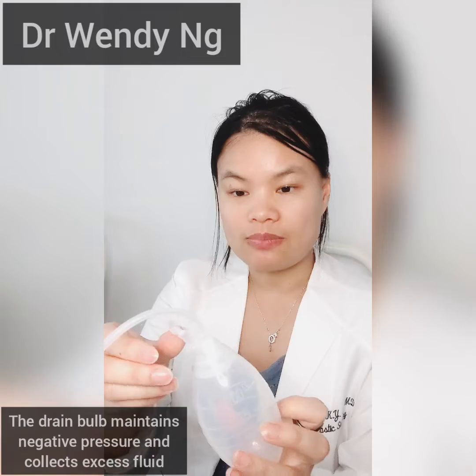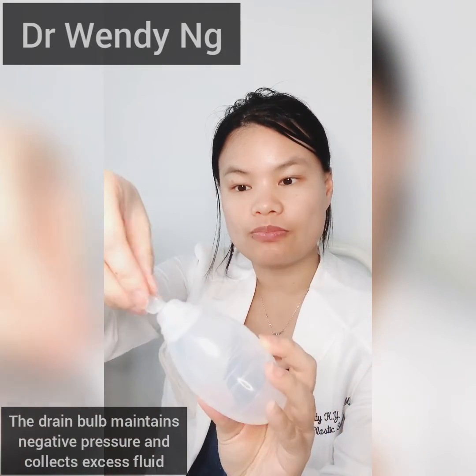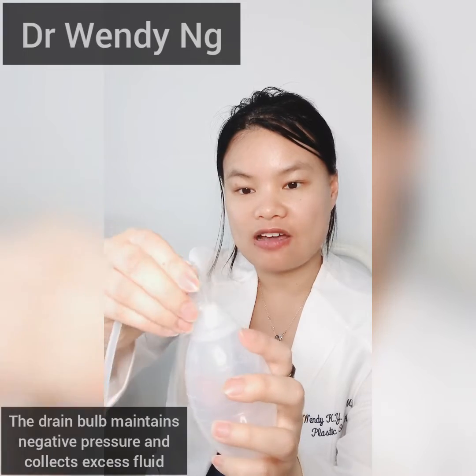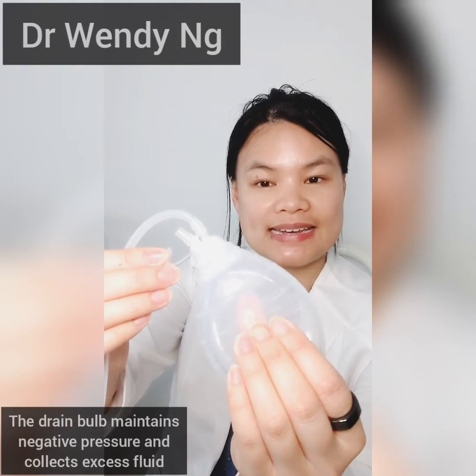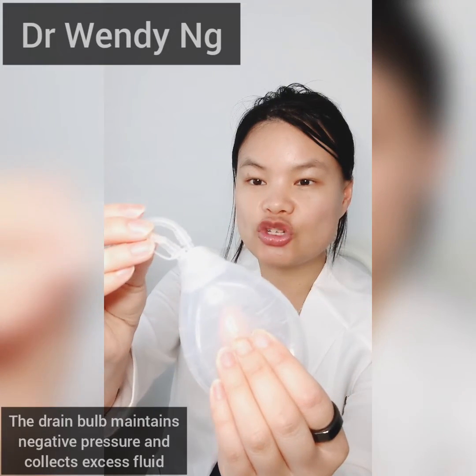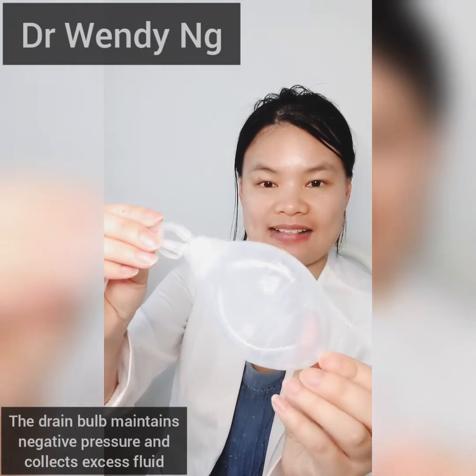On the drain bulb, there's a small cap. The cap can be removed, and then the bulb is squeezed to create the negative pressure. Then the drain cap is replaced and the negative pressure is held.